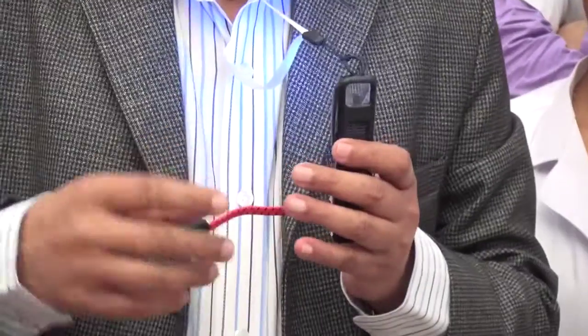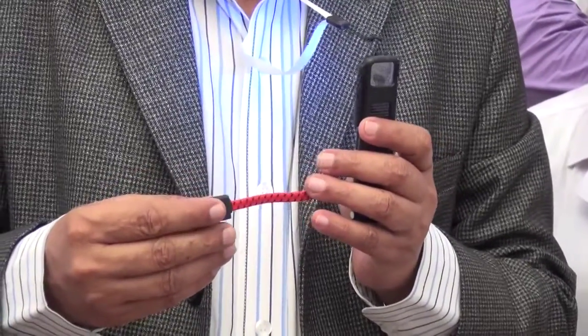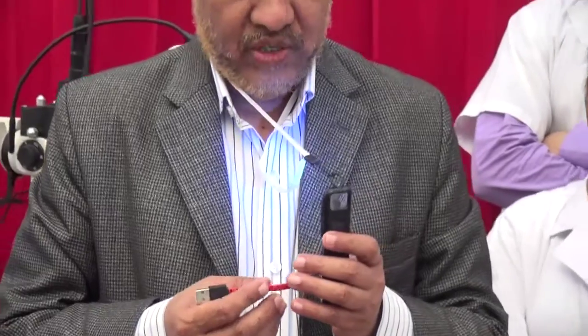Charging the ArcLight with the USB port for just 20 minutes is enough for day-long use.